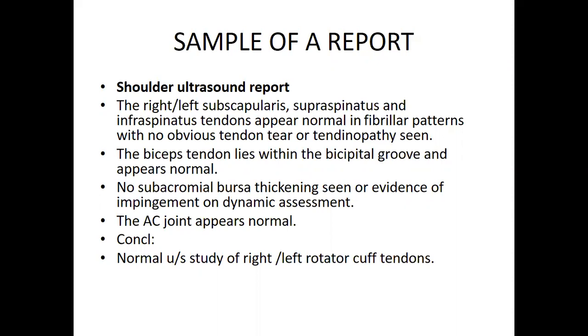So for this one, the first point is the right, the left subscapularis, supraspinatus, and infraspinatus tendons appear normal in fibrillar patterns.